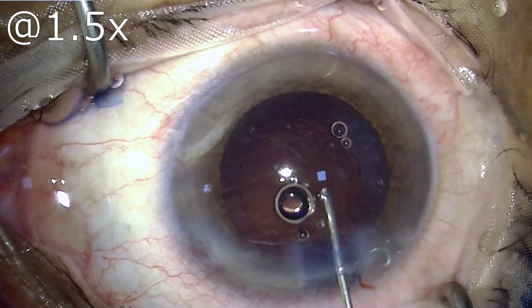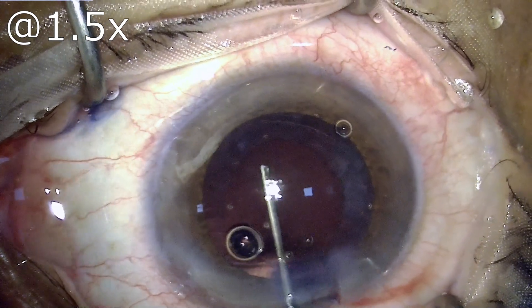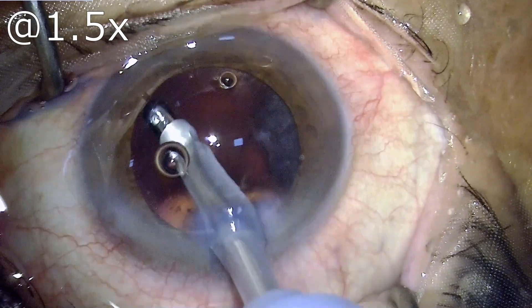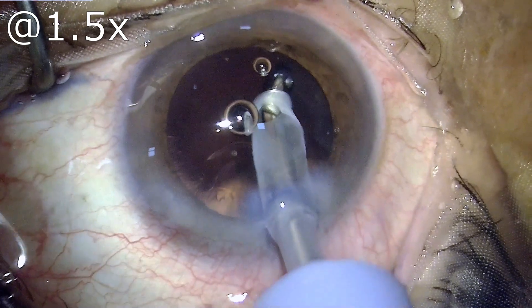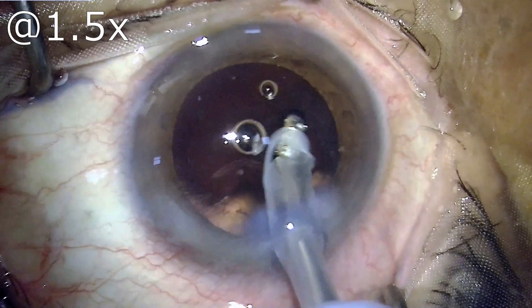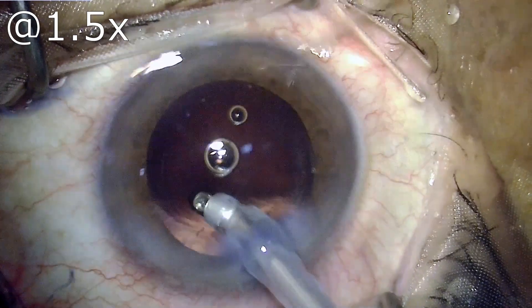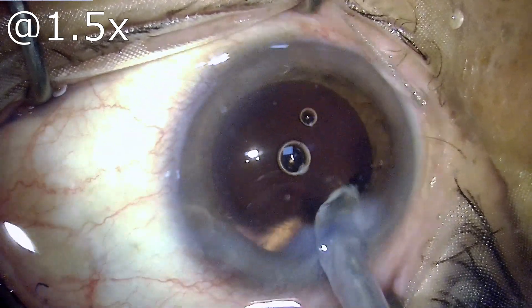I also demonstrate this technique of polishing the capsular cells using the viscoelastic material and the cannula itself, then proceeding to remove the cortical fibers which are scanty. One needs to have a clean bag to have minimal post-operative intraocular inflammation. Having a curved I/A tip has the advantage that you don't need to twist too much — simply rotating the tip allows you to reach the fornices of the capsular bag.